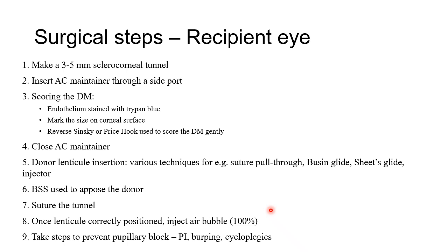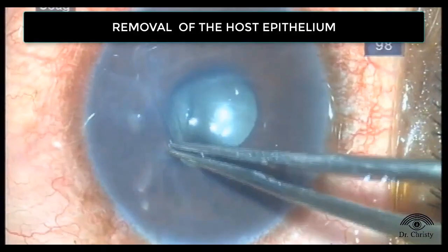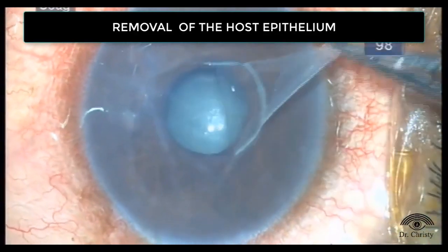And then we burp it, or we reduce the size of the air bubble such that pupillary block does not happen. There are other steps we take to prevent pupillary block. That includes an inferior PI, burping I told you, and of course cycloplegics. So let us just look at the surgery. Remember the steps that I told you.